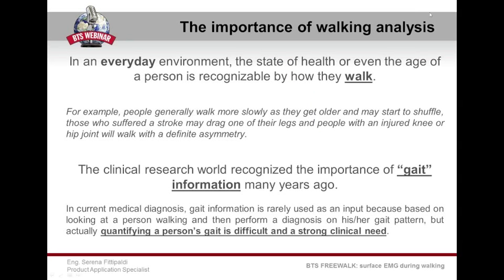First of all, it's very important to understand why in the last 20 years clinicians and researchers are so focused on the importance of the analysis of the walking pattern. For sure, it's something that we do every day. Walking is a very common movement. It's something that we do without any particular involvement, very naturally. But it's really important as a movement because it can give us information about the state of health or even the age of a person.